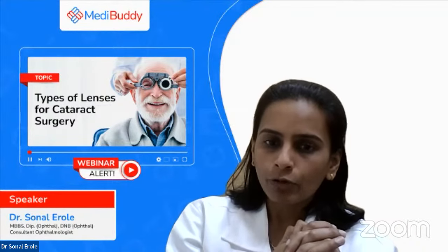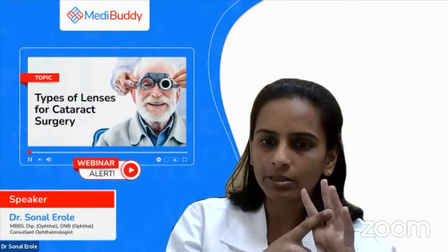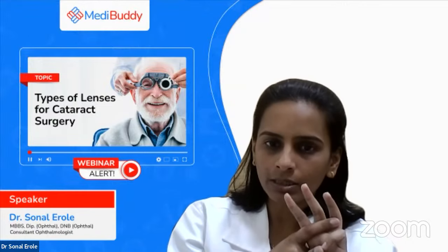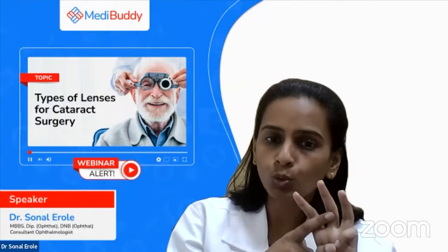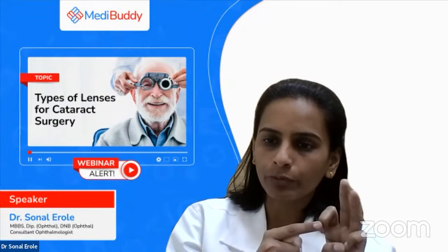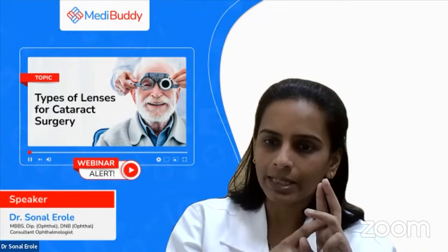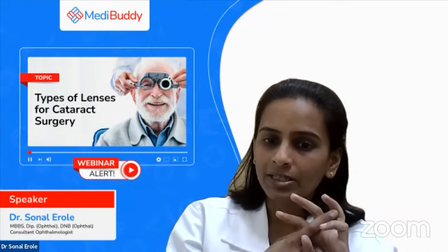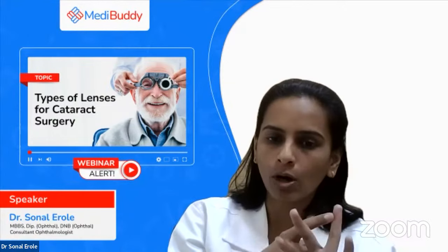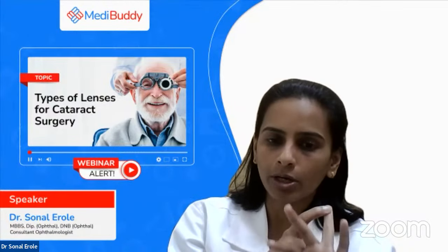Which type of lens is better for cataract surgery? As I already said, it depends on the patient's need, the patient's age, and the patient's willingness. Sometimes patients need their near vision to be good also, and then they can go for the multifocal lenses. If the patient is just sitting at home and is okay with glasses, they can go for the monofocal lenses. If the patient has an active life and still has to do outdoor work and all these things, then they can go for an extended depth of focus or trifocal lenses.